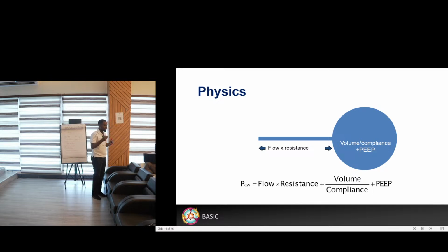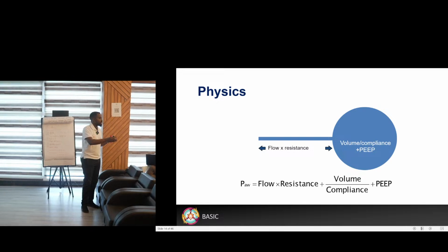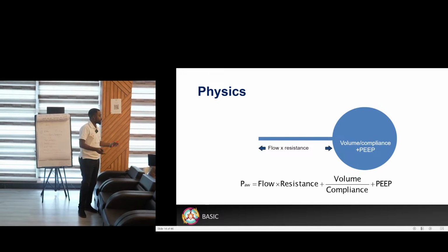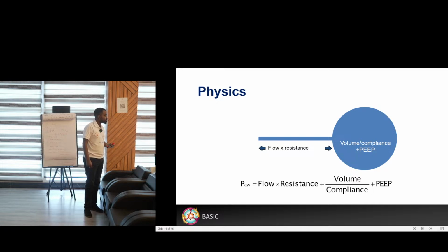Just ask yourself, you were using this pressure in the beginning, why is this pressure now going up? The recommended plateau pressure is less than 30. But in a normal patient, physiologically, the pressures are usually even less than 15 when you start ventilating them. So you shouldn't wait until they go up there before asking yourself. But it's a very good scenario.